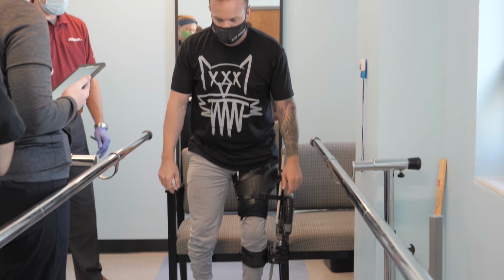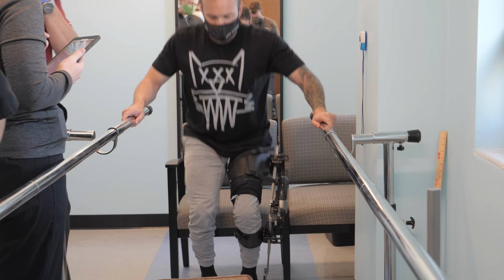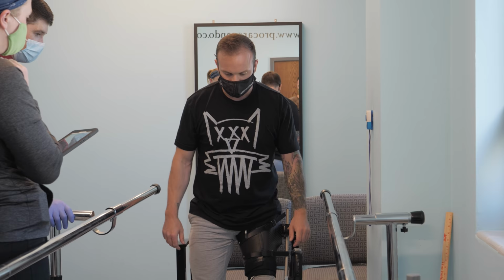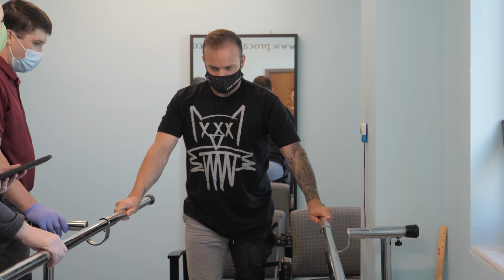We'll go five more. We'll be at max at five more. I'm just really trusting it. Let's see what happens. Let's go five more. Please don't press like that. Now you sit down again. Remember, you've got to lean your weight back and then forward.